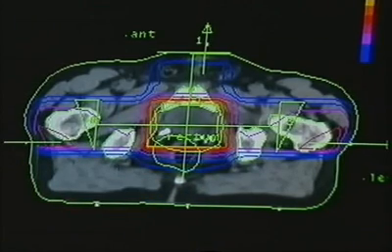As Alison said, this picture comes from a CT scan of the patient, and it shows a cross-section through him just below the waist. His back is facing downwards, and the bright white areas you can see are the bone of his pelvis and spine. And as we shall see later, the wedges aren't really inside his body as the picture suggests. This is just a convenient way of showing them on the computer.